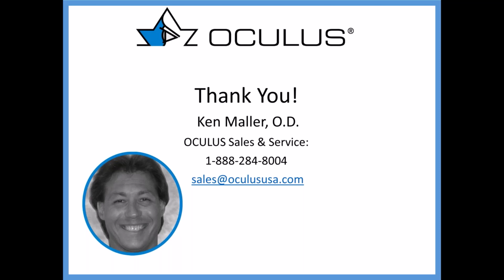I actually prefer that. Now, as far as impression-based technology, I'm not really going to get into that. That's not really appropriate subject matter for here, but I do not do any impression-based technology in my office because that's not typically what I'm having to deal with, such as vaulting up glaucoma shunts and things like that. Those are not the patients that I see, so I don't really use that technology in my office.